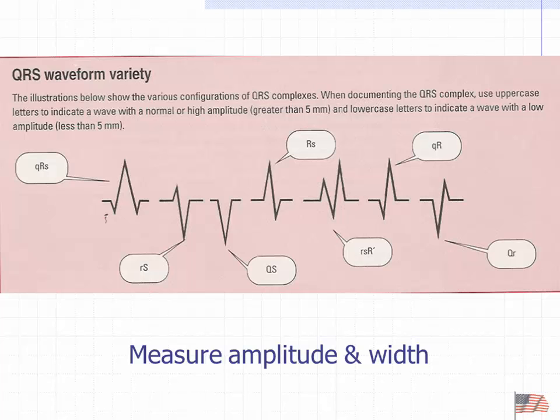Now, we've been using this term QRS complex, haven't we? It's actually a bunch of different waves together. Let me define specifically what each of these are.